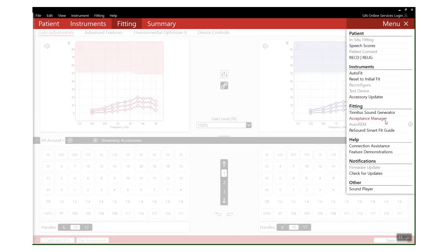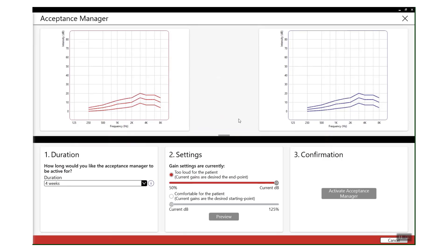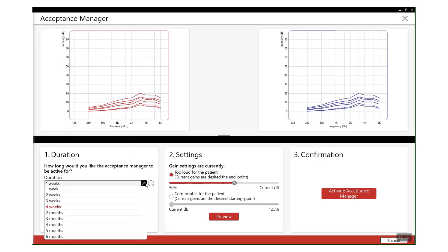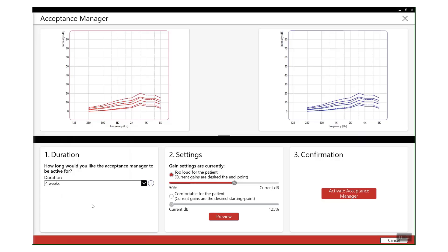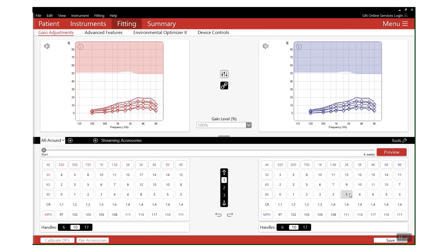And going into Acceptance Manager, what you can do is set a comfortable starting point using this setting here. For example, you might want to take them to 80 percent of their target prescription. You can also set the duration of how long you'd like it to be running for - so perhaps from 80 to 100 percent, you'd like this to automatically increase over the next four weeks.